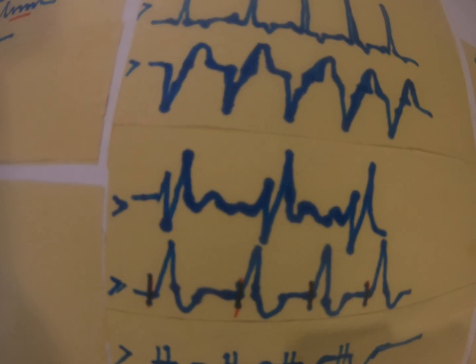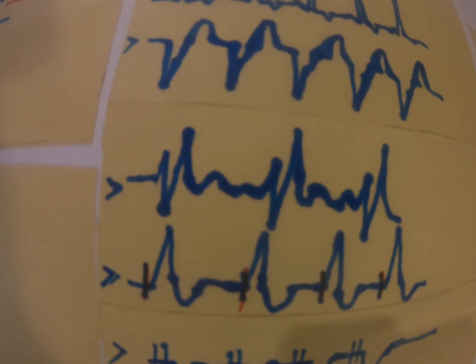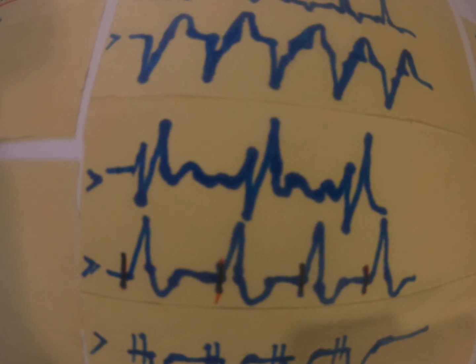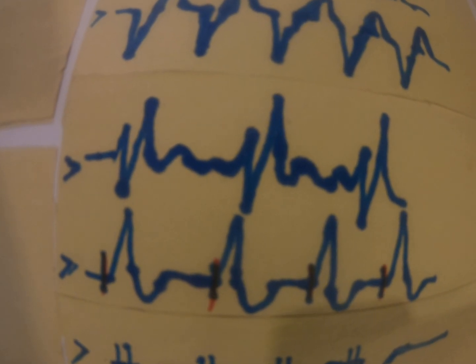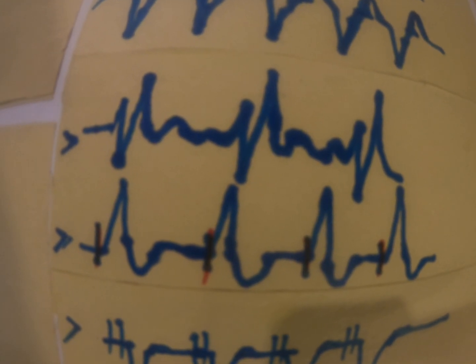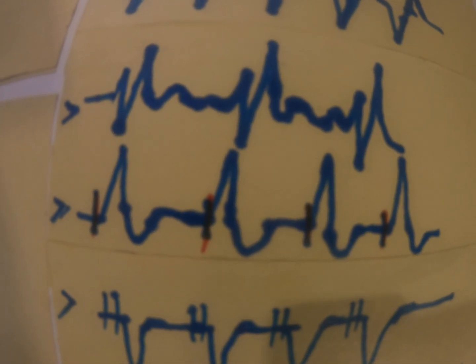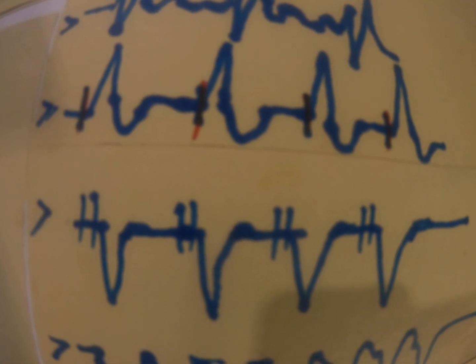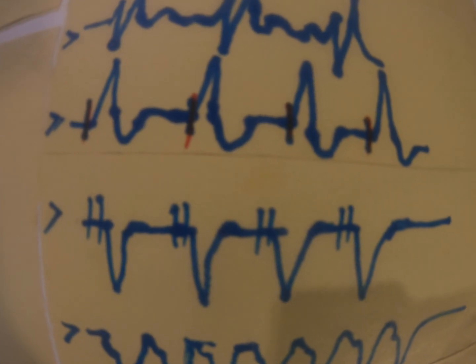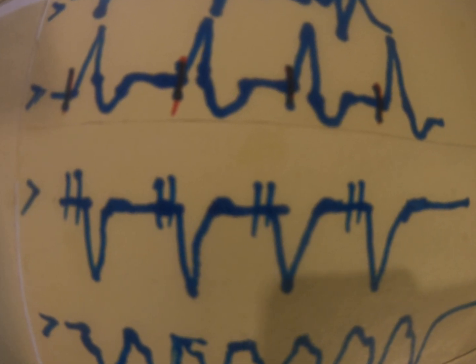It could be a temporary pacemaker, univentricular, permanent, or it could be an ICD because they have also pacemakers with ICDs. Okay, that's before the QRS there. So that's probably a univentricular pacemaker. Sometimes you see a QRS that has two spikes. These are CRT-Ds where we have biventricular pacemakers.